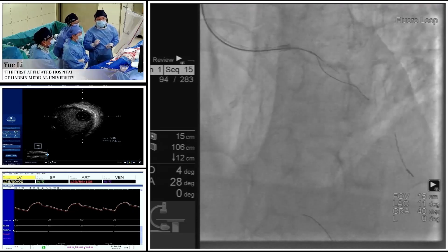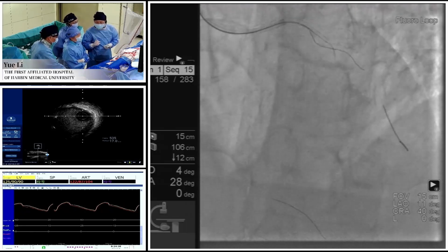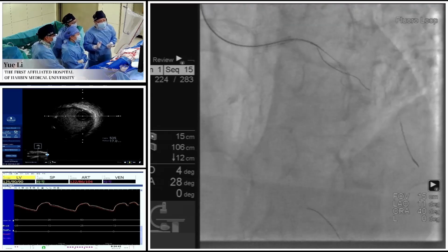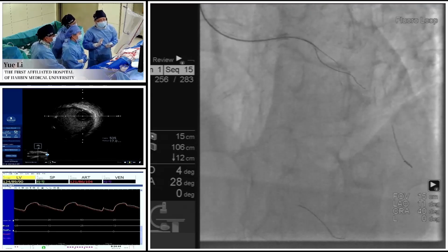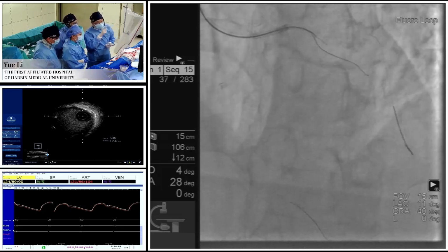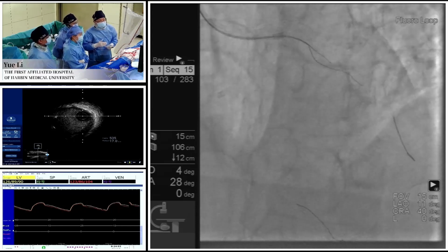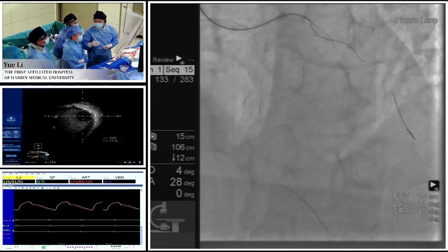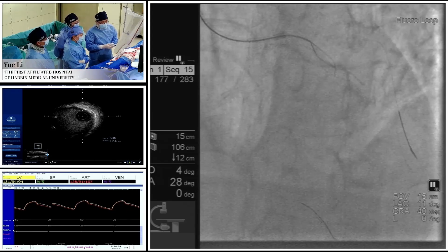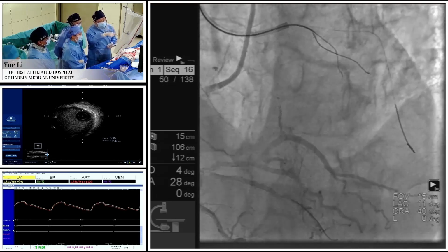the tip and trick to manipulate this wire is to just rotate a little bit, push forward, and just let the wire go by itself. Because the tip of the wire is very sharp, the feedback is not good, so we just observe the tip of the wire, to make sure there is no large curve. So this is optimal manipulation, and you can see we are lucky.